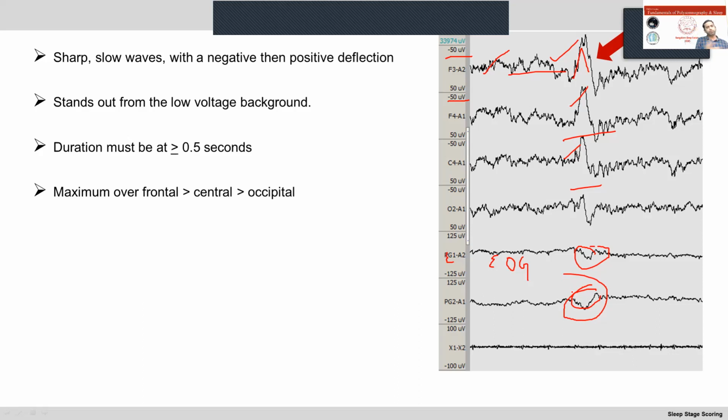What are we measuring with EMG and EOG? These are all electrical potentials: dipole potentials of the brain, the potential across the cornea and retina, and EMG activity from muscles. The activity present in the cortex is so high that it travels because the body is conductive in nature.